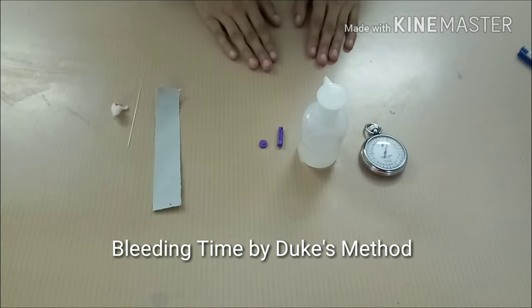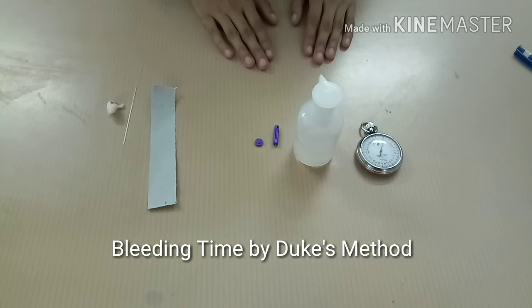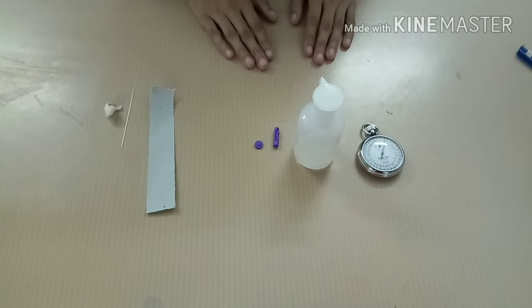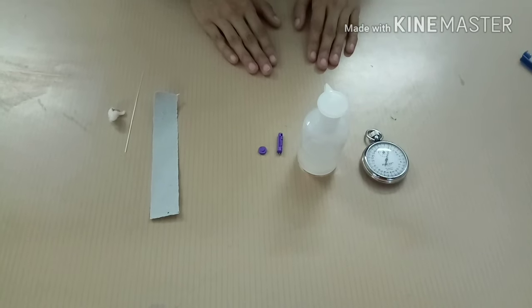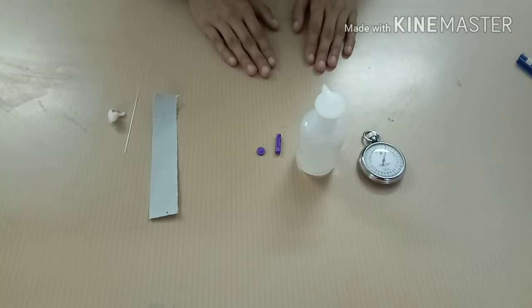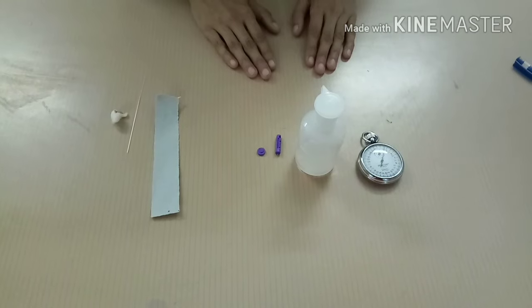Let us perform bleeding time by Duke's method. A deep puncture on skin is made and the length of time required for bleeding to stop is recorded.